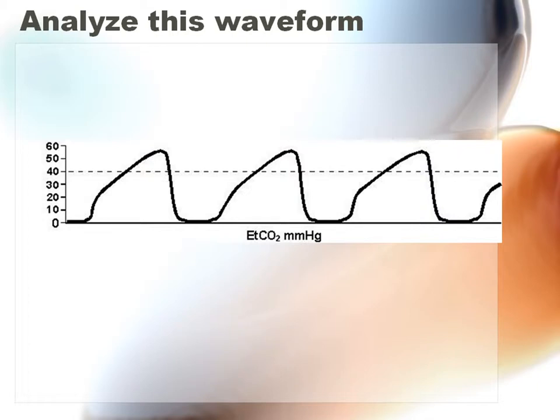You're getting close. If we look at this with my little mouse here, this is obviously our large airways, this big thing, and then right here, this is all of our small airways. So this stuff is fighting to get its way out. Here's your large, here's your small, fighting it out, and then here's your in. So this is bronchospasm.